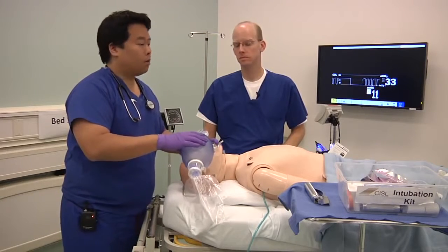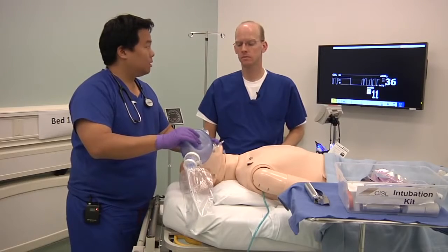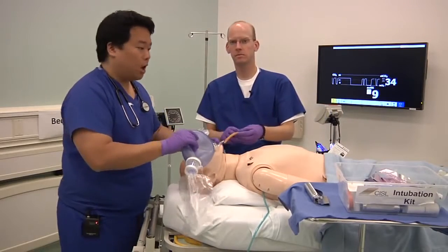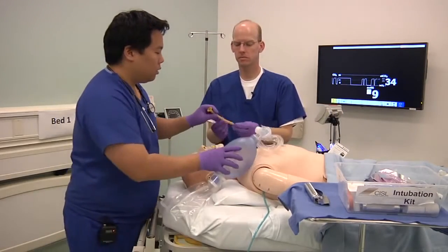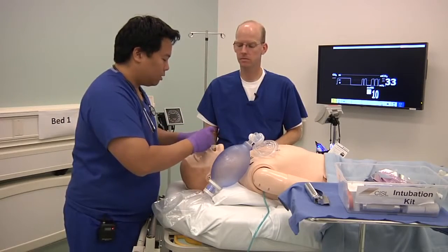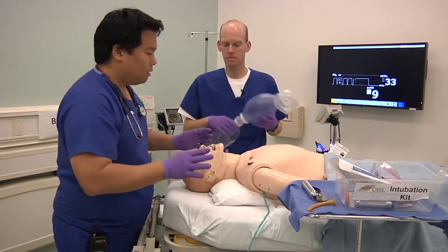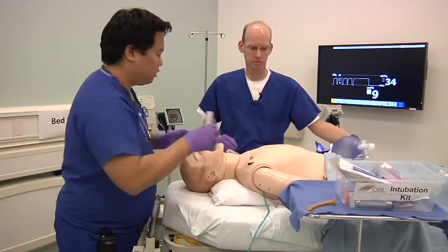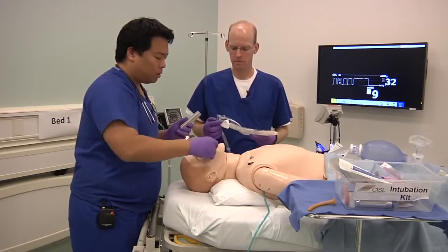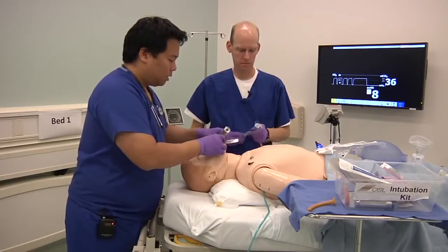Now there are other airways that you can insert as well. You can also insert nasal airways. If you insert an oral airway and you're not still getting good ventilation, you can go ahead and lubricate a nasal airway and insert that into the patient. Okay, so now when you're ready, you can perform endotracheal intubation. As I mentioned, the height of the bed facilitates this. We're not going to go into all the steps of it today. That's really beyond the scope of this tutorial.